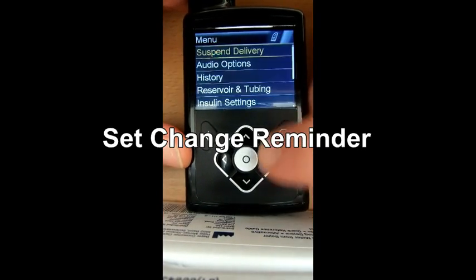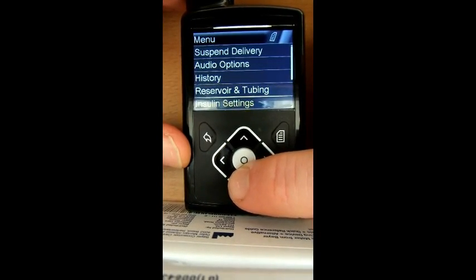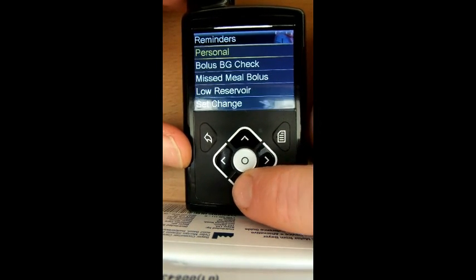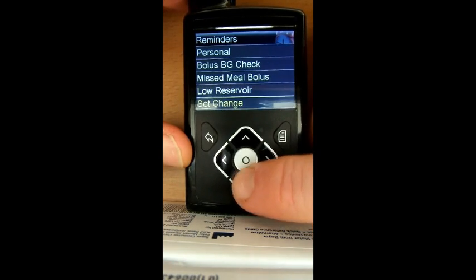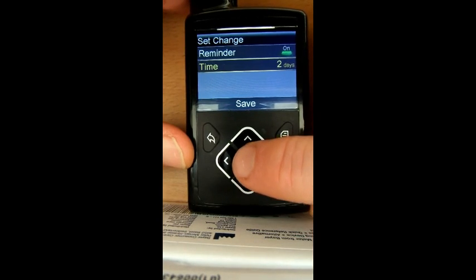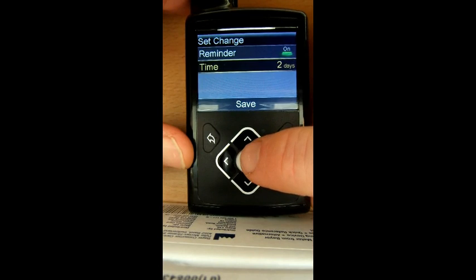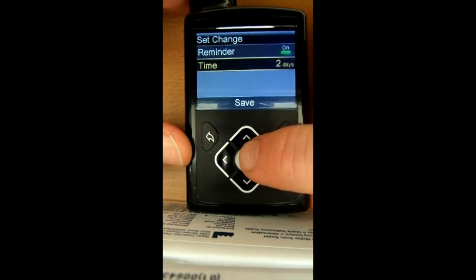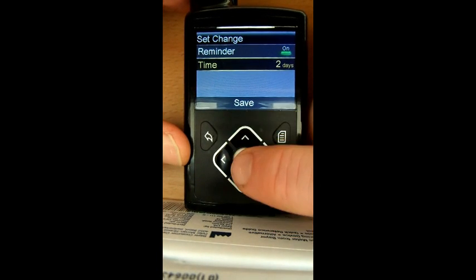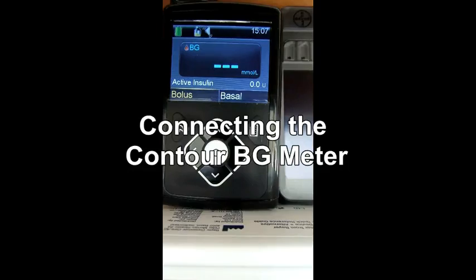A new thing that is definitely going to help me — even with the best will in the world I do forget sometimes to change every two to three days my reservoir and set. Now in the reminder section there's actually a set change reminder, which is pretty good. You can turn that on and choose whether you have it every two or three days. I'm going to set it to remind me at two days, so I know once it goes off I need to change that day so it doesn't run over to three days. Save — perfect.